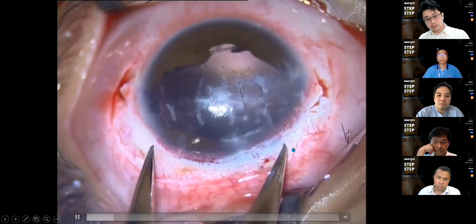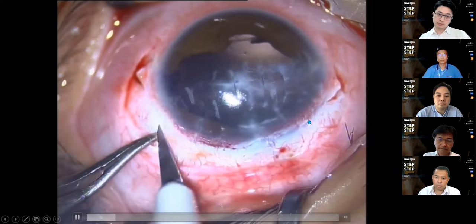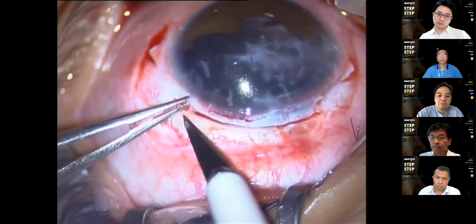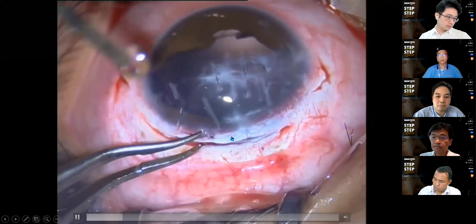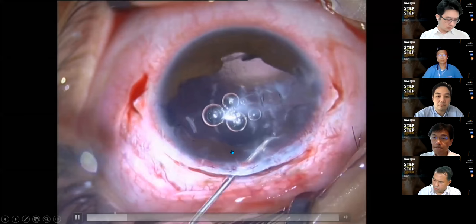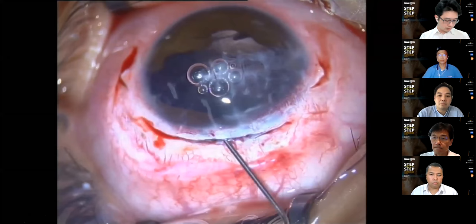Now I have to make a big scleral wound. Usually I do this when the eye is not touched yet, to make sure it's a firm eyeball to go in. And as usual, a 3-step limbal incision. As you all know, the lens that I'm going to insert is a big lens, so I prefer a scleral wound to minimize damage to the cornea by the suture. There are a lot of PAS over there. Then I put in a viscoelastic, basically to make the eyeball firm and to protect the endothelium.